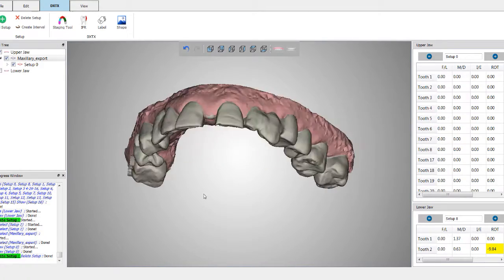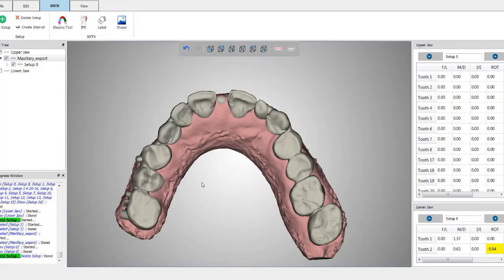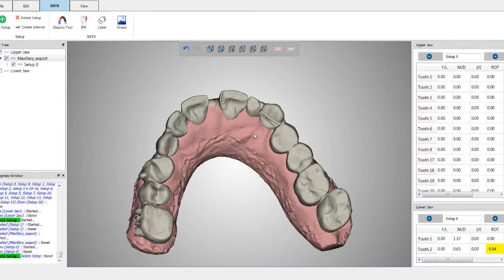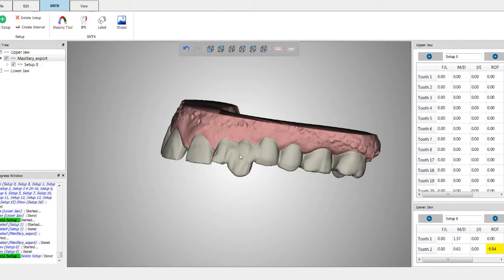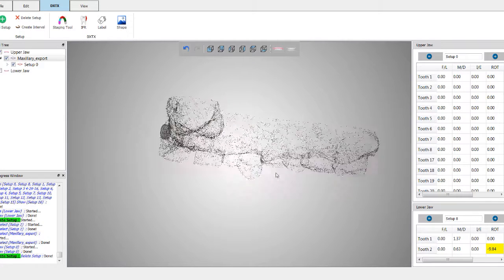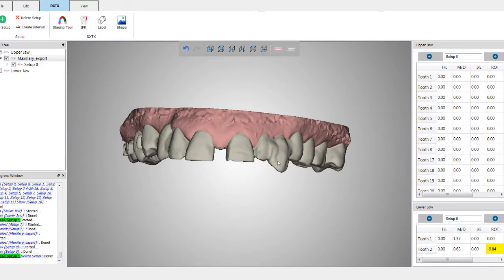And what I have done that works extremely well is to simply, when we're doing the intraoral scan of the patient, have the Pontics do a good shade match, order Pontics, and then simply place the Pontics in between the patient's teeth here, which is wax. We place those there with wax over here. You can see that this one here could have been placed a little higher, but we can adjust that digitally.